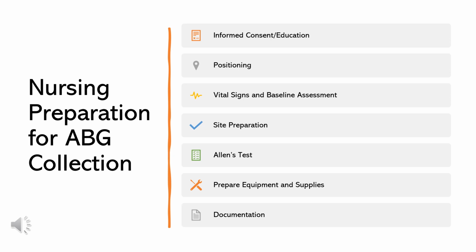For positioning, assist the healthcare provider in positioning to provide easy access to the artery and minimize any risks like hematoma. Make sure to document baseline vitals and respiratory status. This initial data serves as a point of reference for identifying any sudden changes post procedure.